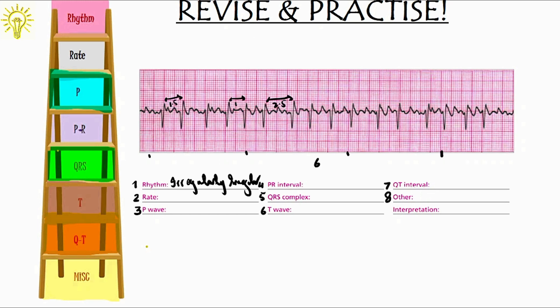So, this makes a 6 second strip of 30 large boxes. And in these, we have how many R waves? 1, 2, 3, 4, 5, 6, 7, 8, 9, 10, 11, 12, 13, 14. So, times 10 method, it turns out 14 into 10, 140 beats per minute.